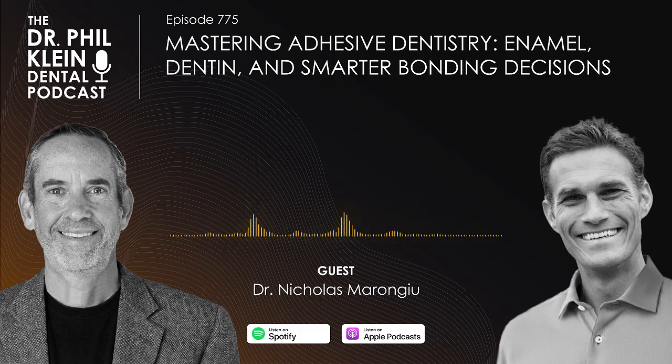Like you said, we're all human, things happen, and the important thing is to understand what took place so that we can make adjustments so that we don't see it continue to happen. So for us, if a restoration comes off, and we'll talk about just a debond or a displacement of a restoration, we're grabbing the scope and looking inside. All right, well, what's going on? Where's the resin? Do we see resin still bonded within the intaglio surface of that indirect restoration, or is the resin bonded onto the core of the tooth?